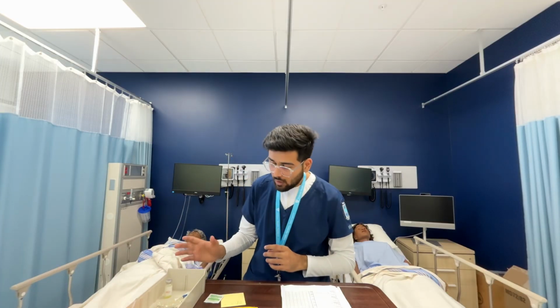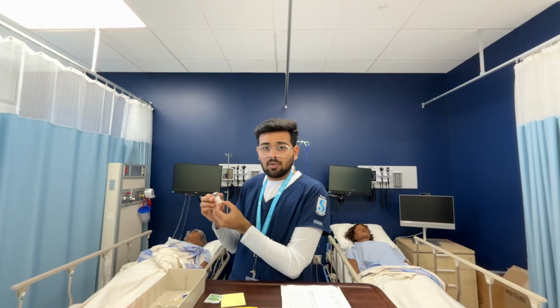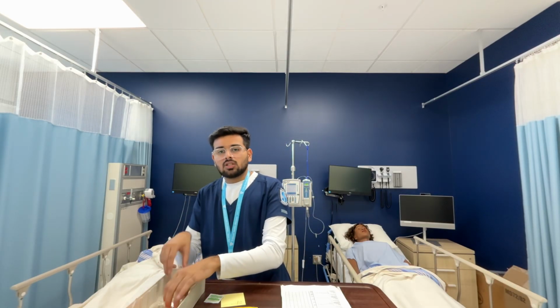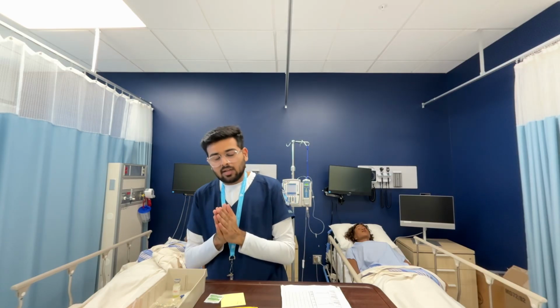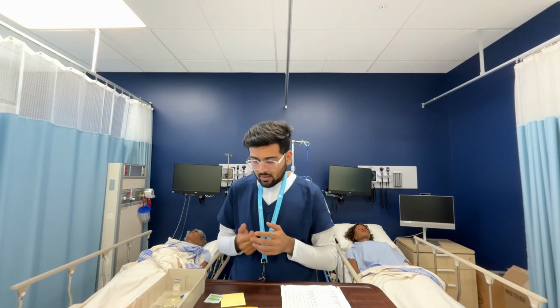Now, before I begin my first check, I have checked that my medication is not expired. Patient is not allergic to my medication, and my medication is compatible with normal saline. So my compatibility safety check is over there. Now I'm going to start with my first check.